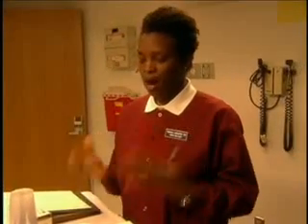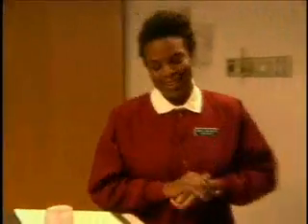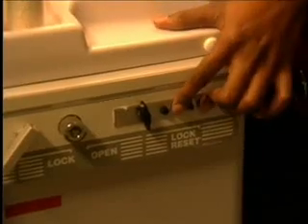You seem pretty comfortable with the procedure. Ready to administer? Are you sure you don't want to? What is it with you guys in this? You're so confident in the information, but you... It's just, it seems so complicated sometimes with the syringes and the adapters and... sometimes it feels like I can't fit anything else into my head. Just relax. It takes some time to feel confident in everything. But you're very bright, Tamika, and I have a lot of faith in you. Here to help, okay? Thank you. That's very reassuring. Okay. All right, let's do this.